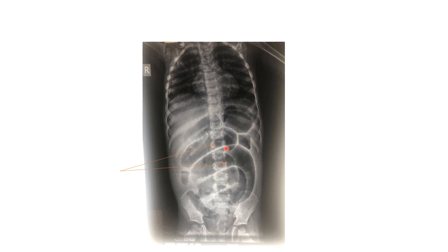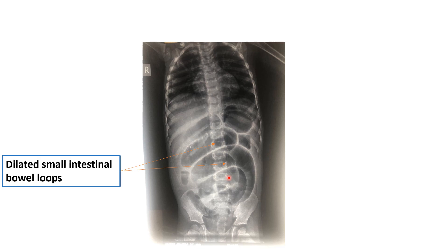This abdominal X-ray was taken in the lying down position. Ideally, for intestinal obstruction, we should take the X-ray in upright or standing position. The abnormal radiological finding here is dilated intestinal bowel loops present in the center of the abdomen. Characteristically, the mucosal folds are present throughout the circumference of these bowel loops — these are dilated small intestine bowel loops, suggestive of small intestinal obstruction.